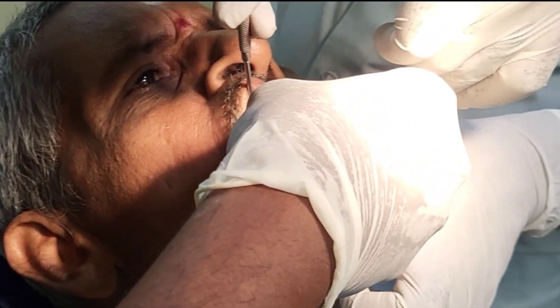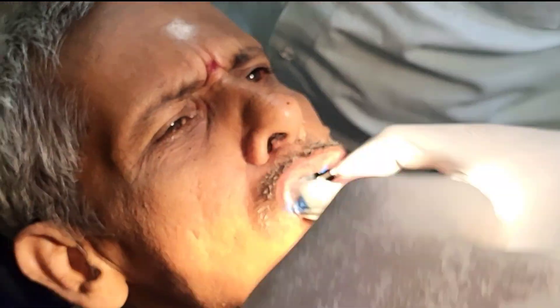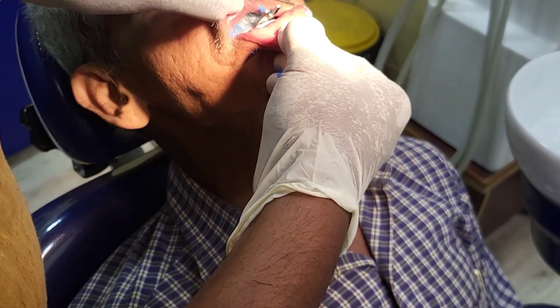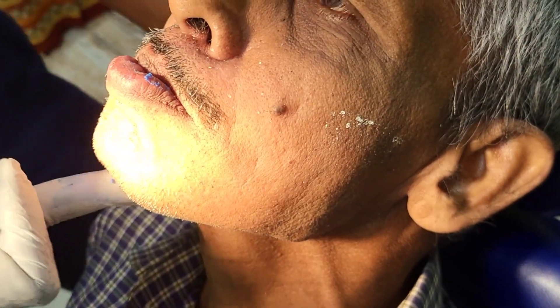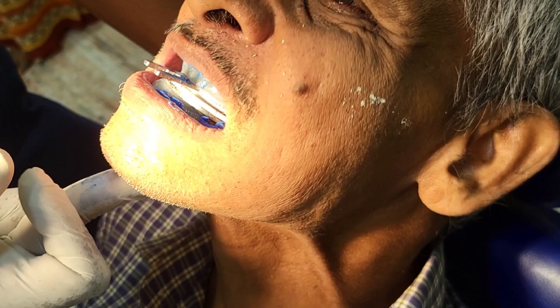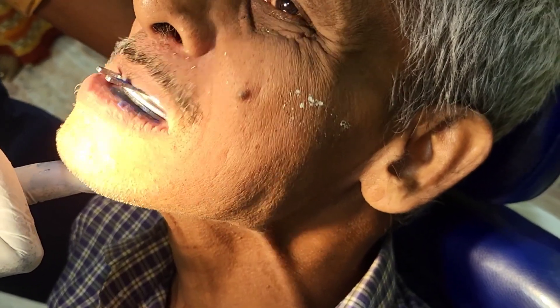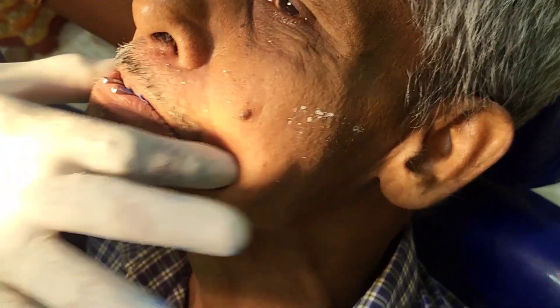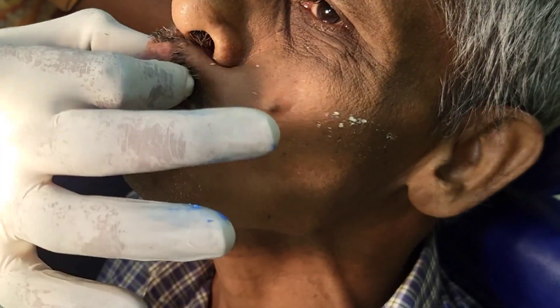In conventional procedure, we have to do the movements for the upper arch also. Since it is a closed mouth technique in BPS, there won't be much movement needed for maxillary border molding. For maxilla, ask the patient to be at rest without any strain in the cheek, then chew the tray handle and smile widely. For conventional, we have to do labial, buccal flange and distobuccal flange movements by pulling the lips outward and inward, then ask the patient to move the mandible right and left to record the distobuccal area, and record the PPS by asking the patient to say 'HA'.